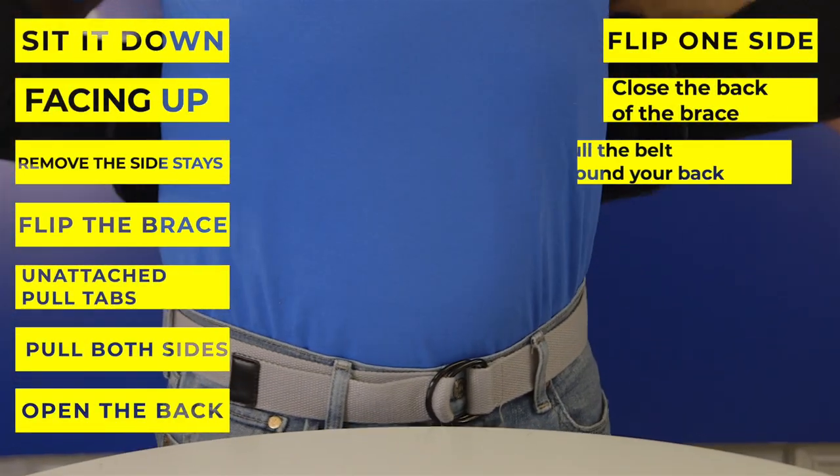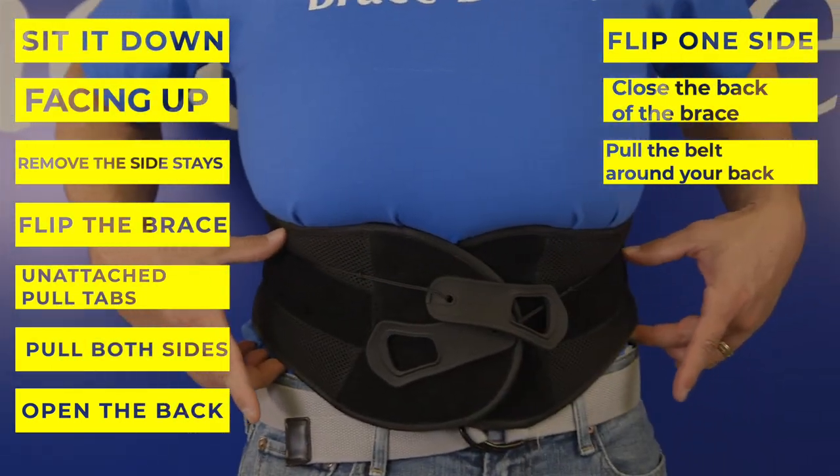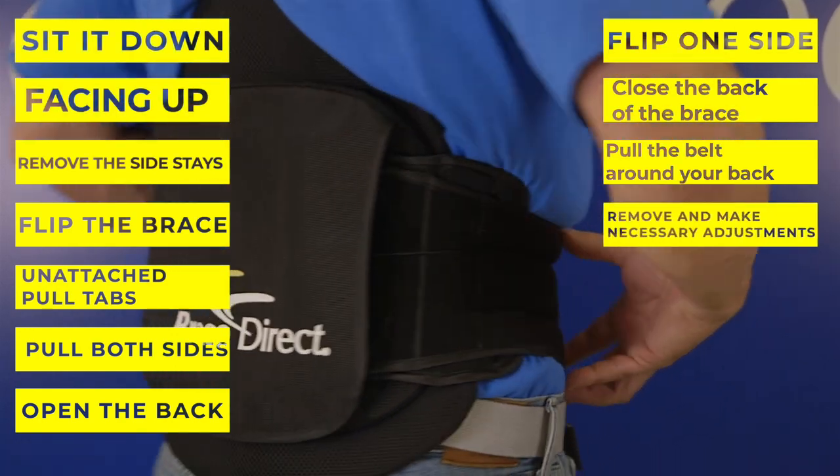Pull the belt around your back with the back panel just on the tip of the buttocks. The front of the brace should line up and velcro at your belly. If the front of the brace does not line up, remove and make necessary adjustments then reapply.